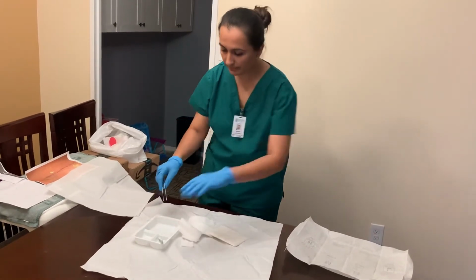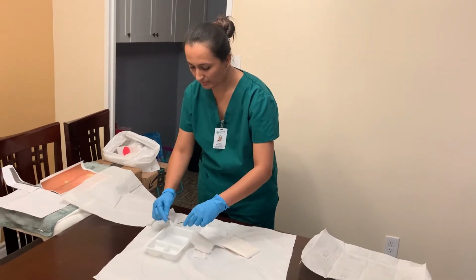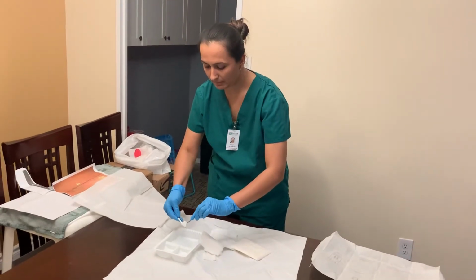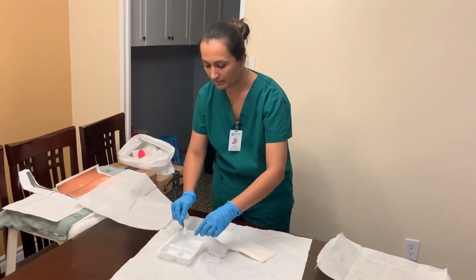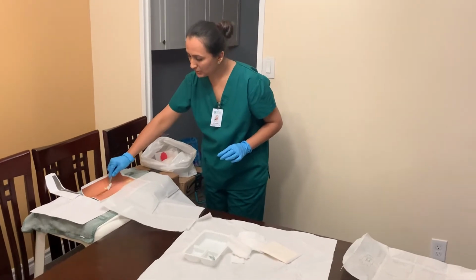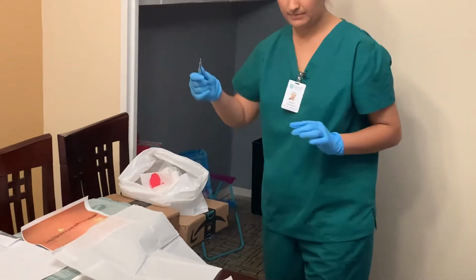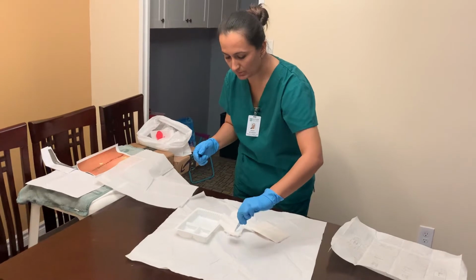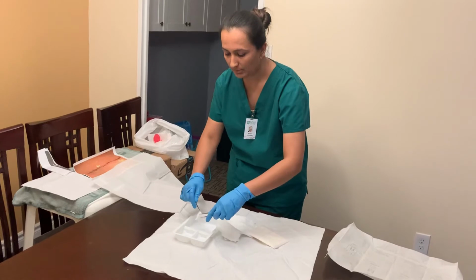So we'll take a 2 by 2. Make sure I squeeze enough water. And I'll clean the middle, top to bottom. And we'll take one more 2 by 2. We're going to do the same thing, repeat the procedure.